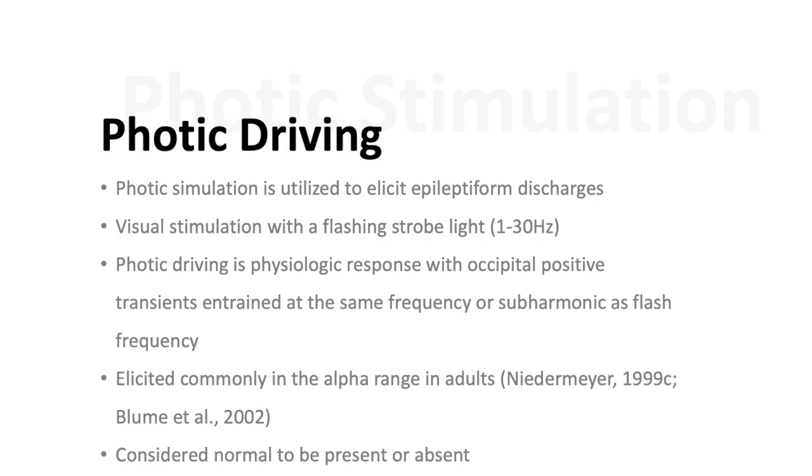Visual stimulation with a flashing strobe light can elicit a photic driving response, which is composed of occipital positive transients, which are entrained or time locked at the same frequency or a subharmonic as the flash frequency. Subharmonic means half or a multiple of the frequency. So if you had a flash frequency of 10 hertz, it would be 5 hertz.